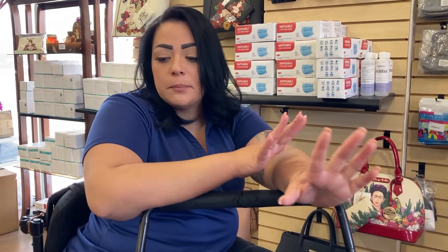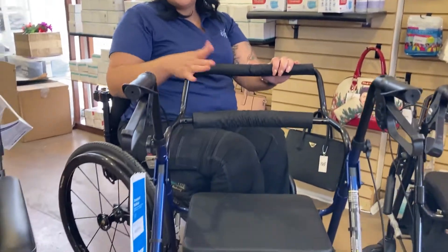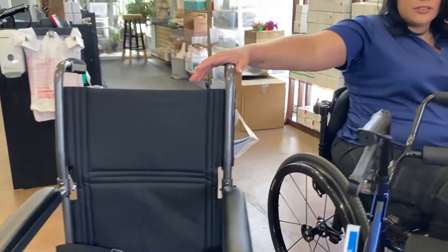Hi, welcome back to BEK. Today I'm going to give you a pretty cool option for those people that either travel a lot, doctor's appointments, grocery stores — but you need two-in-one or you need two different items, this one's going to be perfect for that. This one's going to be your rollator that turns into a transport chair, so you don't have to be carrying both — this turns into both, so it's super cool.